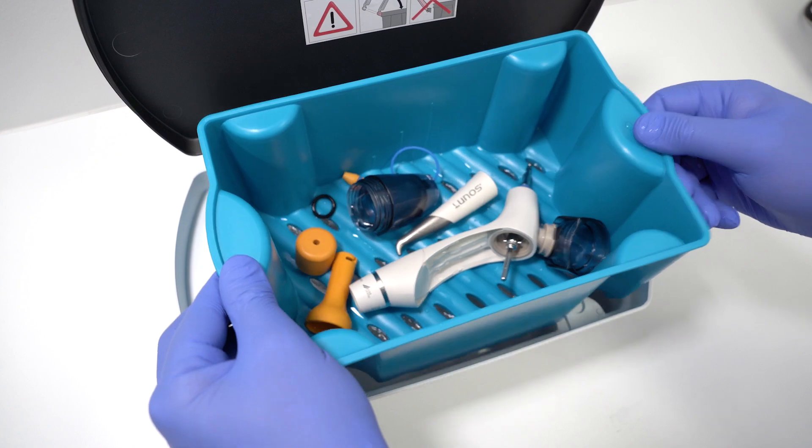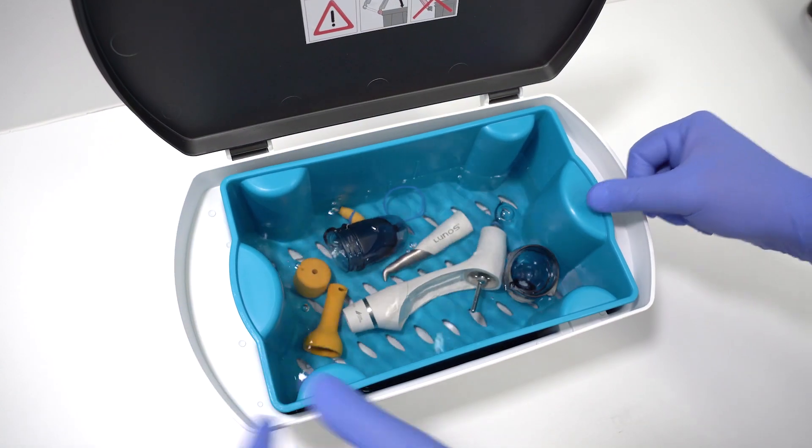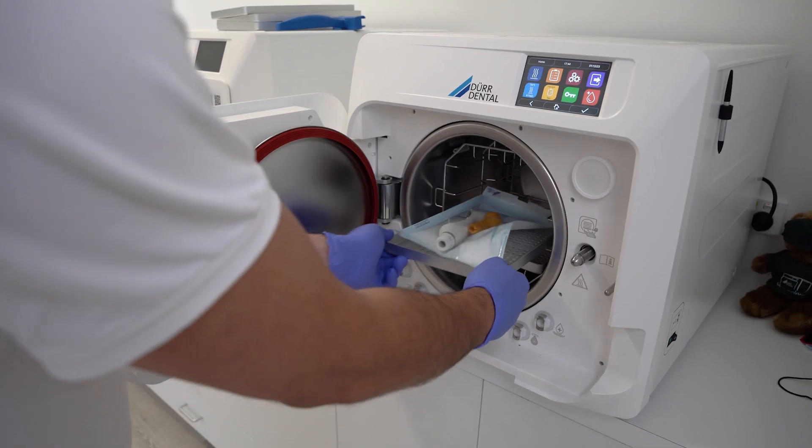All components can be completely submerged into the ultrasonic bath, thermally disinfected, and sterilised.